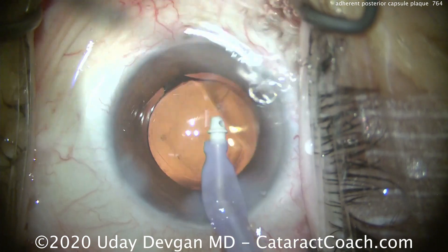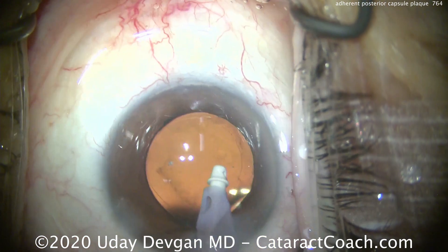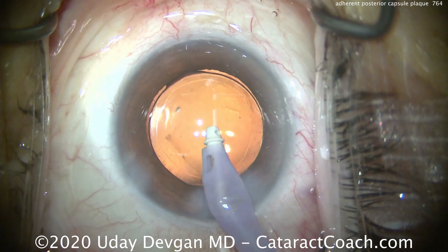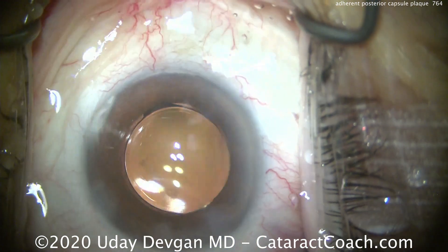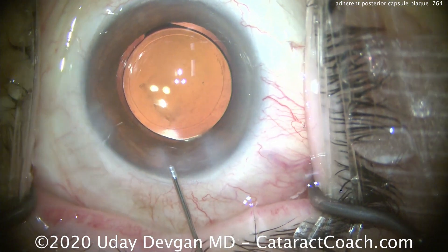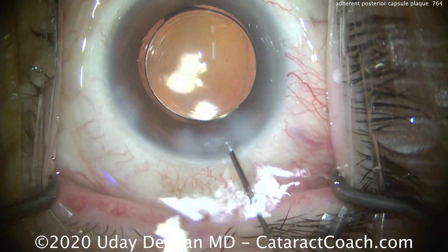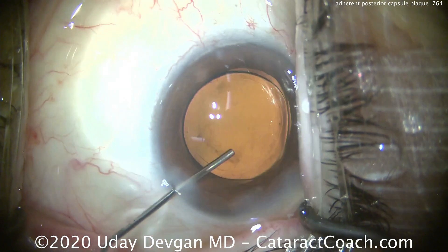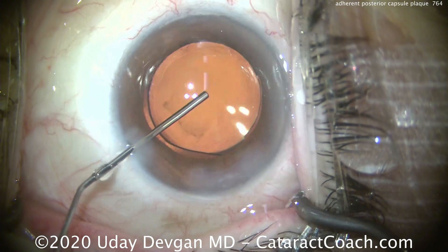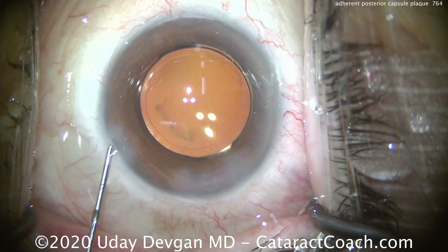Even if you had a bigger central plaque right in the middle of the visual axis, there's no harm in leaving it. Wait a month or two or three for the patient to heal up and the capsule to fully contract, then do a YAG laser capsulotomy — which is such an easy procedure and will give you a beautiful outcome. My advice in these patients with fibrotic tissue stuck on the posterior capsule is: first, do no harm. Fix the cataract — that'll be an amazing outcome — and you can always go back and do a YAG laser capsulotomy.